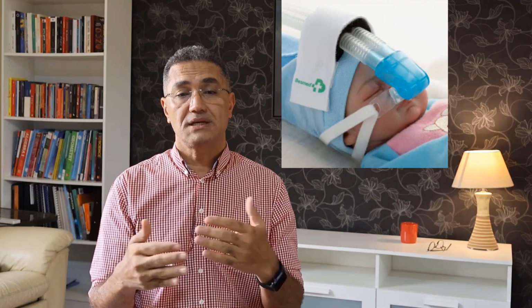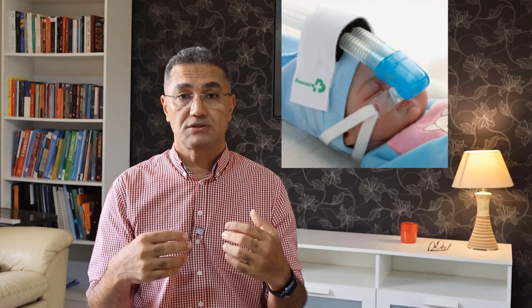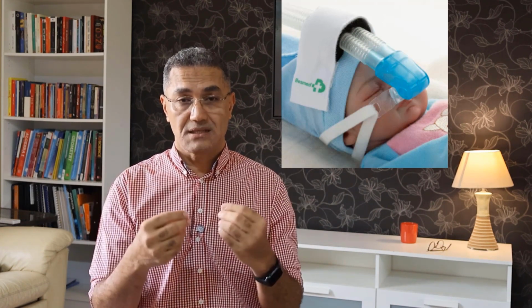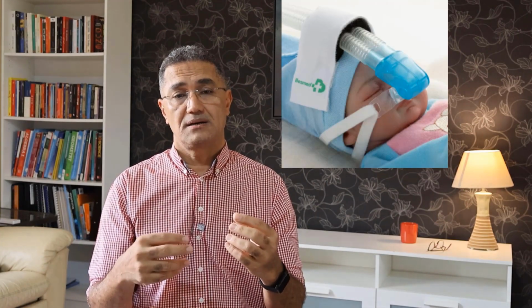In addition, using the mask for long periods isn't always good for the patient. It can cause problems such as pneumothorax, which is when air leaks into the space between the lung and chest wall, potentially causing the lung to collapse. Another issue is that if the mask isn't sealed properly, it can interfere with the patient's ability to breathe in, inspiration, or breathe out, expiration. In some cases, the mask can even have the opposite effect of what we want, leading to complications that can make the patient's condition worse instead of better. So what can we do in these situations?